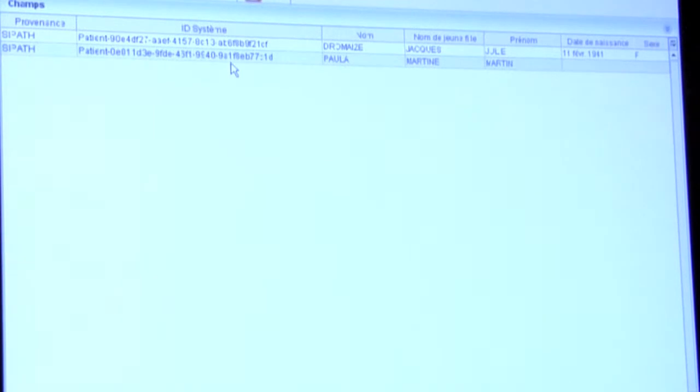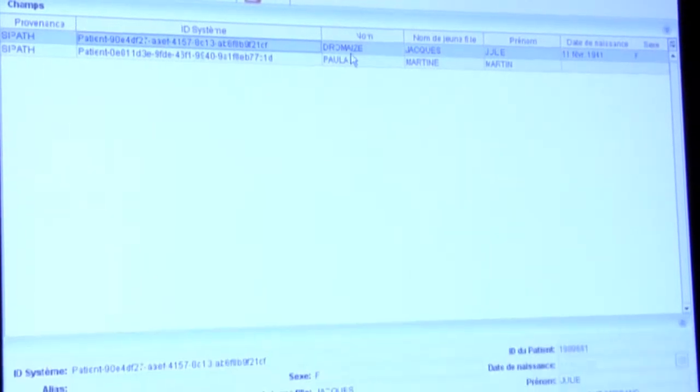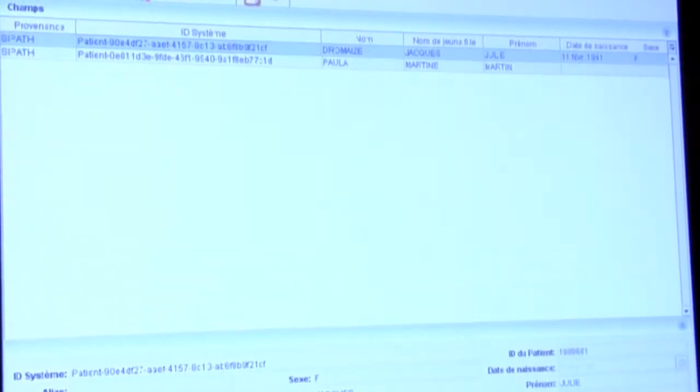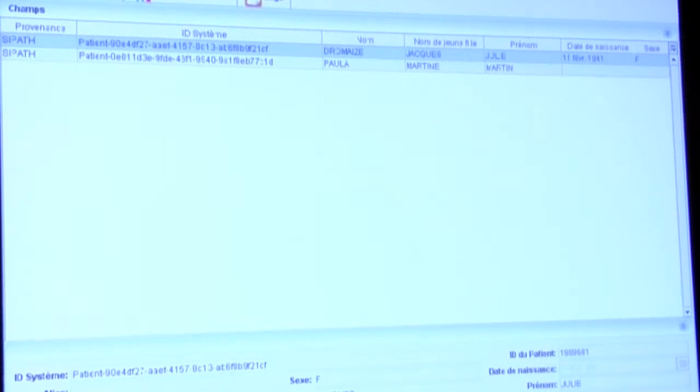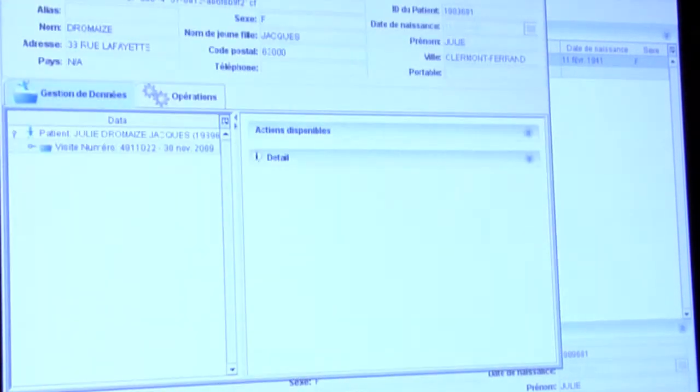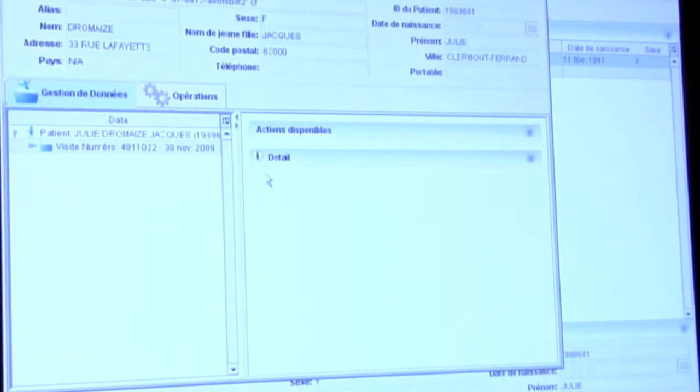So we can open a patient, Mrs. Dromez, and we will show the patient sheets concerning this patient.